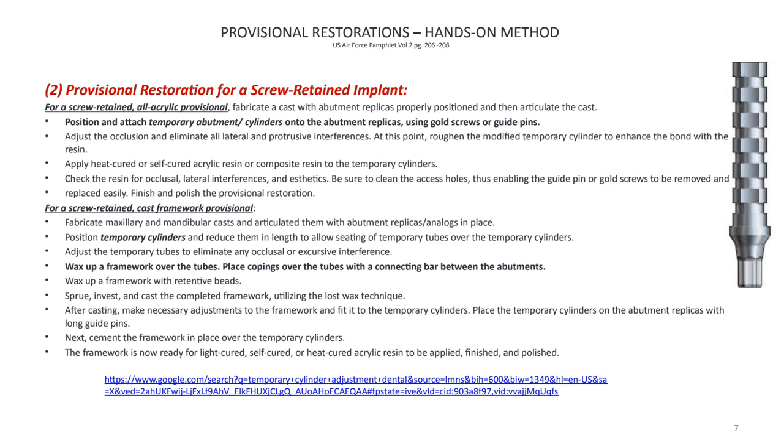between the abutments. Sometimes we can do a connecting bar. Sometimes we can do what's called connecting between each unit of the bridge. In terms of the provisional restoration, when we have a framework, we really want that connection between each unit of the bridge to be very strong.